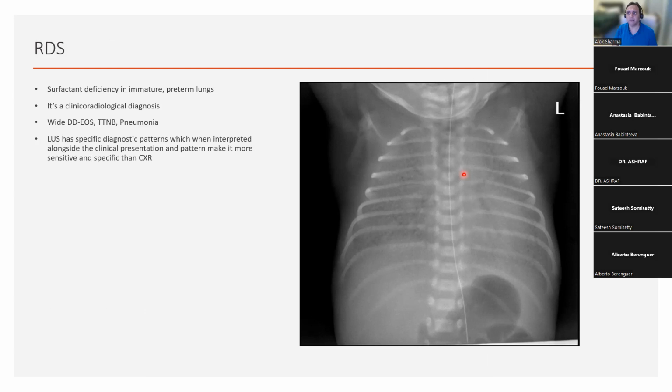Because the risk of not getting a chest X-ray and blindly putting a drain in, until you're confident that you can demonstrate these signs, is not without risk. And hence, I'll be sharing a protocol with you that I've developed that helps to keep you safe during that process. Does that help? Okay.